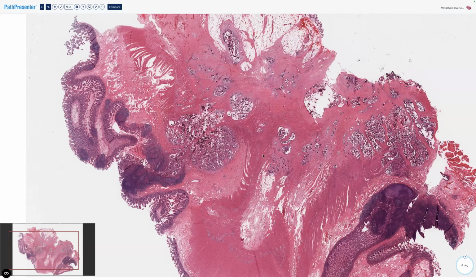Okay, so here we go. You may or may not have encountered breasts yet with chemotherapy, where you've got to grade the response to chemotherapy, haven't you? Yes, sometimes you have to grade the response to chemotherapy here. Fortunately, it's much easier. You will need to look it up the first time, but basically it's lots of tumor, hardly any response, and there are very few of those.